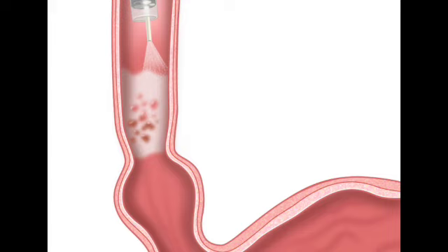Okay, so they go all the way down to that border, and then what? Then they start spraying the acetic acid mist, but they do it in a very specific direction. They spray from the distal end, the bottom, and work their way up to the proximal side, moving backward. Oh, I see. So if we think of the esophagus like a tunnel, they are driving the camera all the way down to the very end of the tunnel where it meets the stomach. Exactly. And then they're essentially painting their way backward. They're laying down this fine mist of acid on the walls of the tunnel as they reverse out.